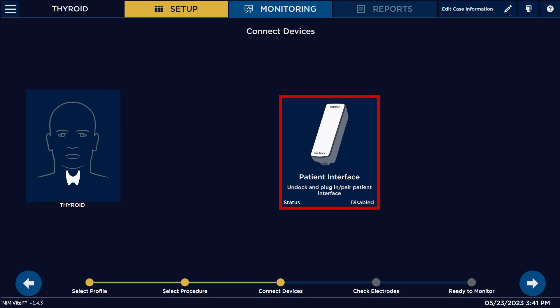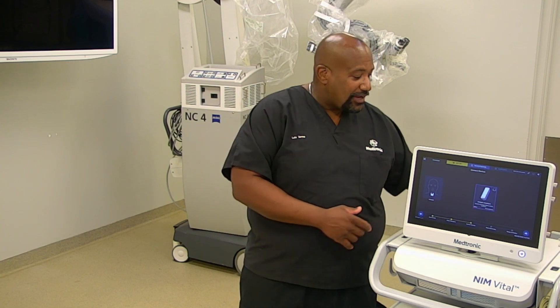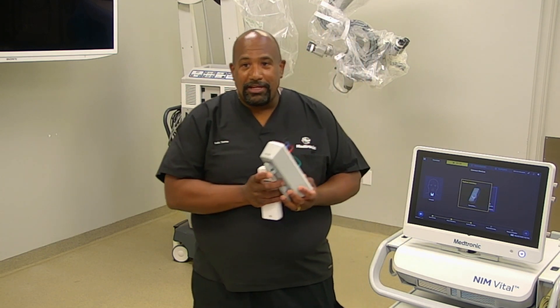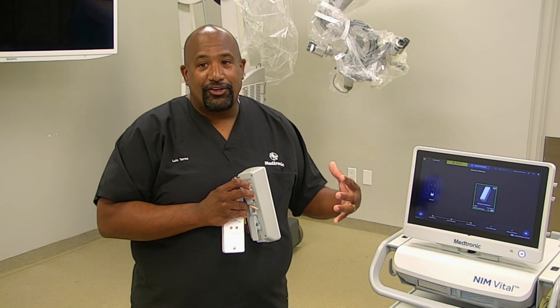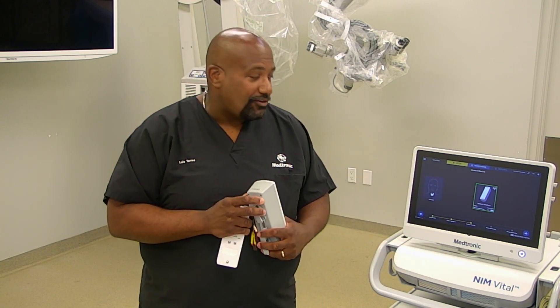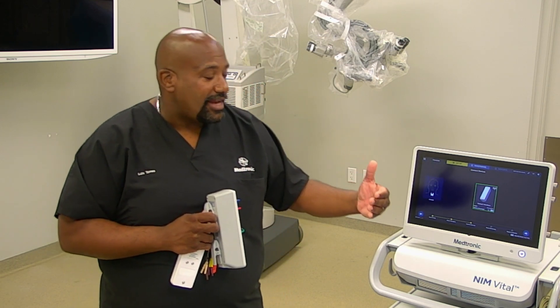This system comes with a wireless patient interface which uses Bluetooth technology. So we're going to undock the patient interface. Once we undock it, we're going to notice that the red square that was here went green. That means that it has seen our patient interface. Once we get to this portion here, we can now proceed to the next step.